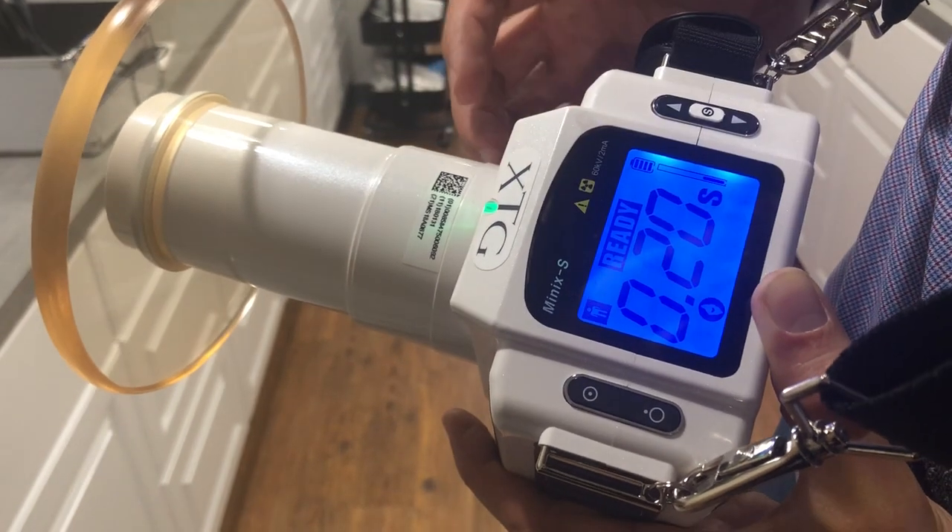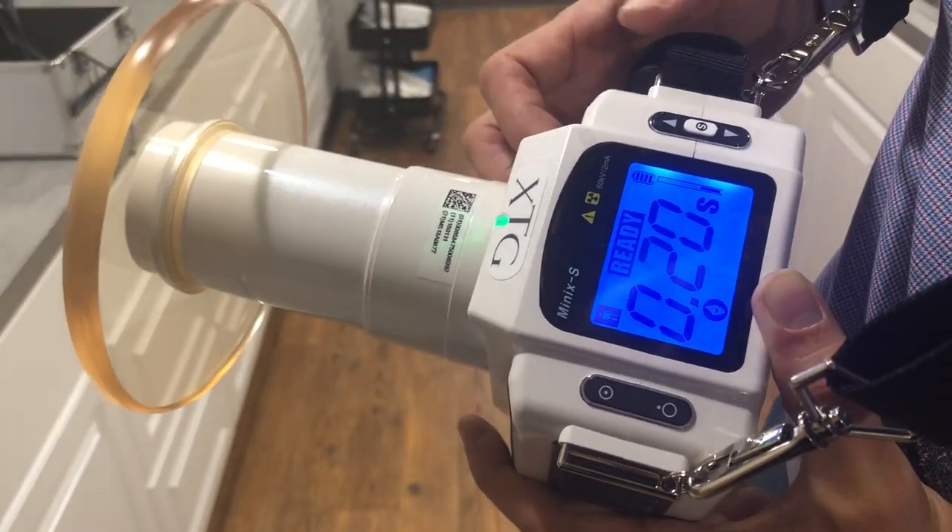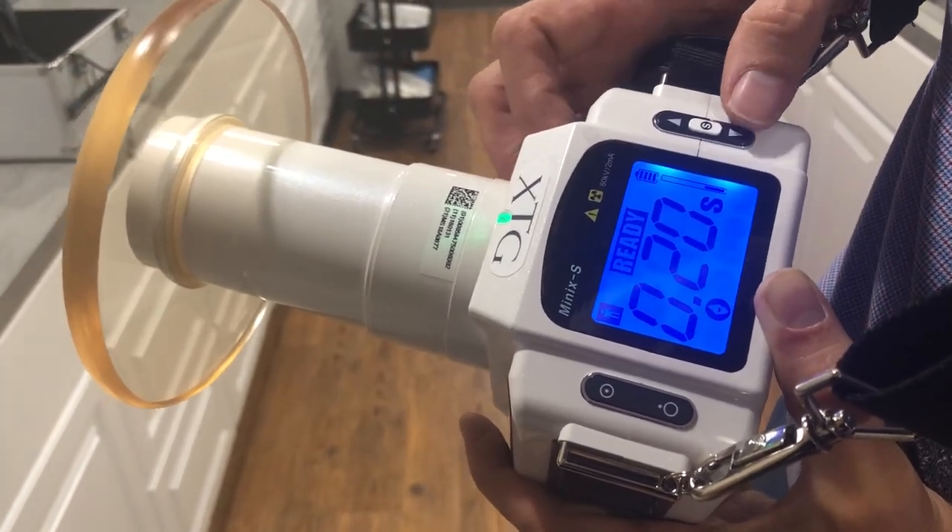Hold it down until the ready light comes back on, and that's already preset for the next time you turn the machine on.